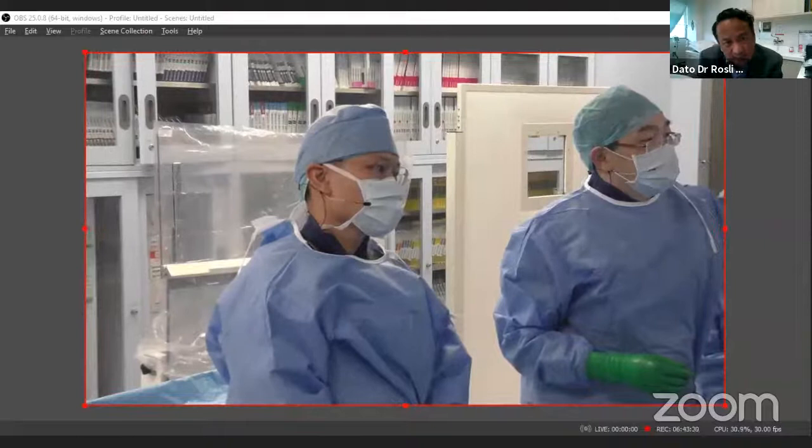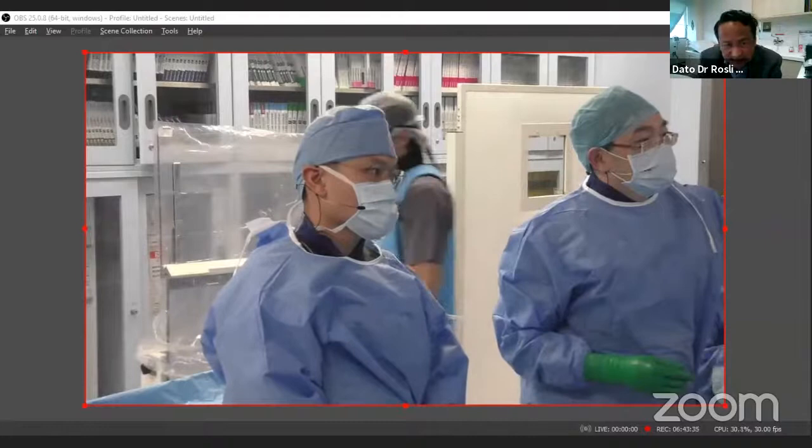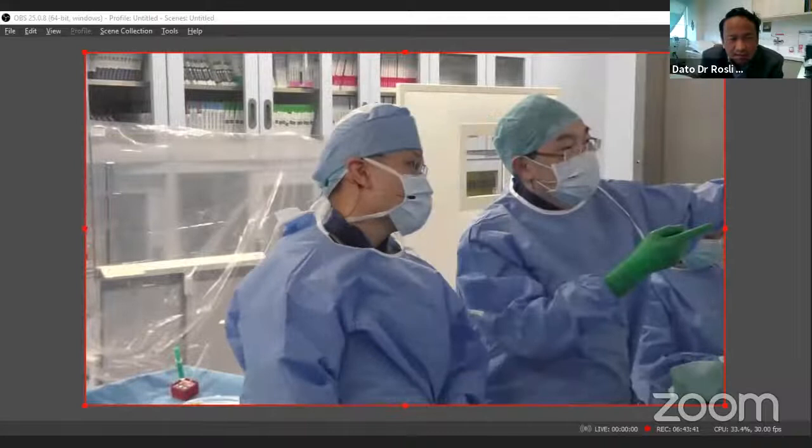But in this case, I would have actually extended a bit more, because you can see that the area where it landed, there was still some disease over there. I'll probably use it a bit longer in this case.